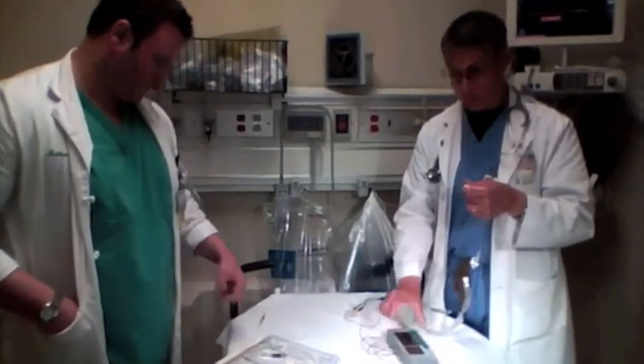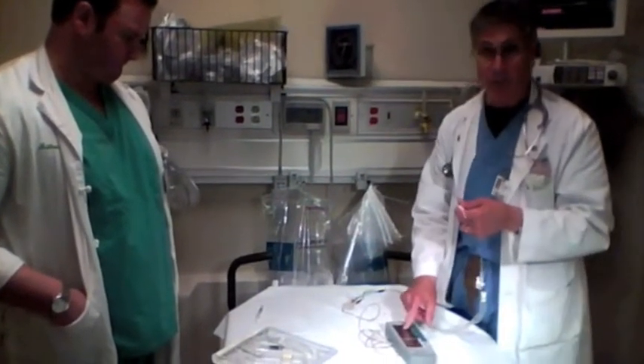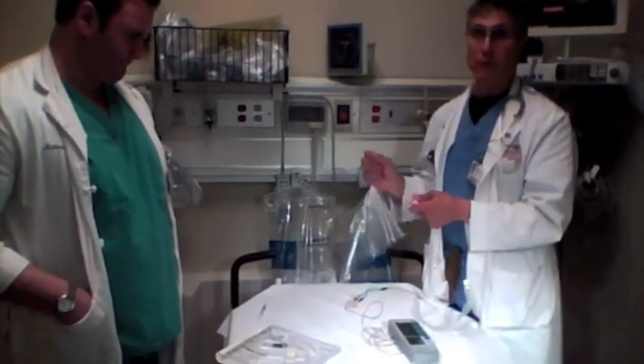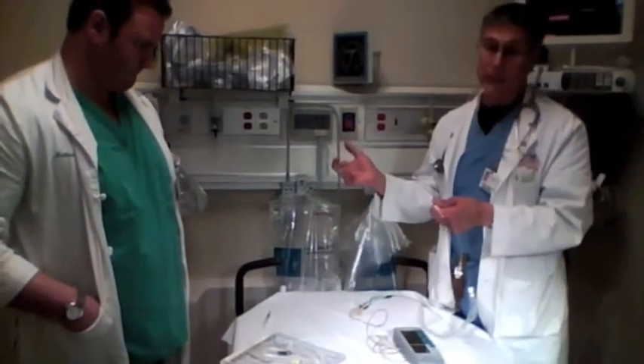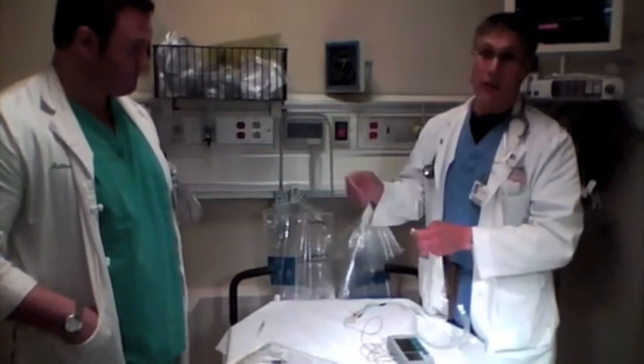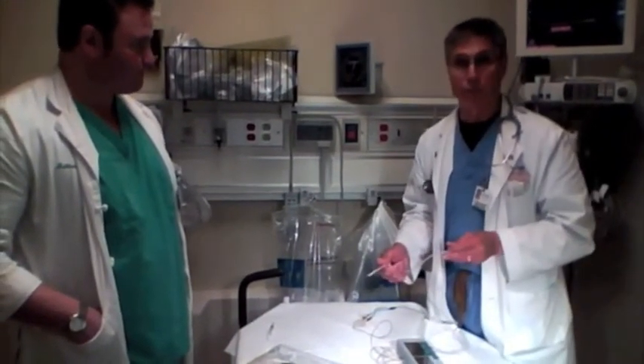To summarize: put a CVP in, turn the box on, turn the milliamps all the way up, turn the heart rate all the way up and adjust later. Put the wire in — the doctor says blow it up, you blow the balloon up, push it in until it captures, let the balloon down. Then drop your milliamps until you lose capture, double that value, and you're done.